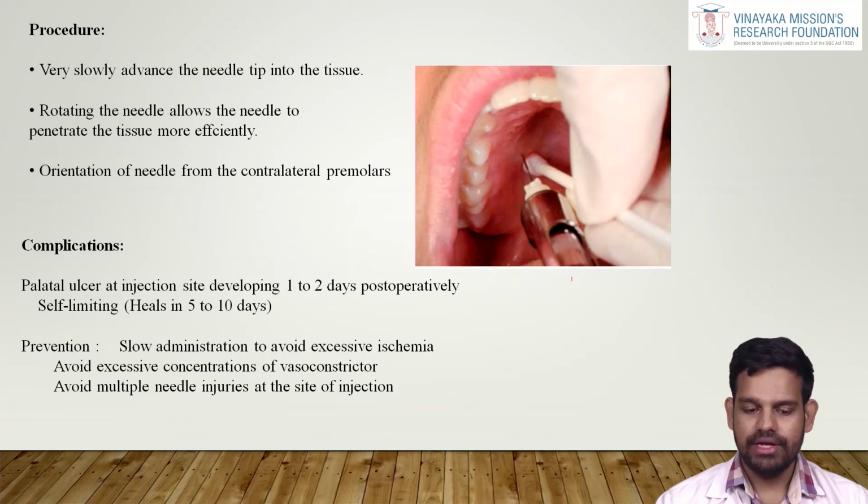The procedure is to very slowly advance the needle into the tissue, and always the bevel should face towards the bone, and orientation of the needle from the contralateral premolar is mandated.